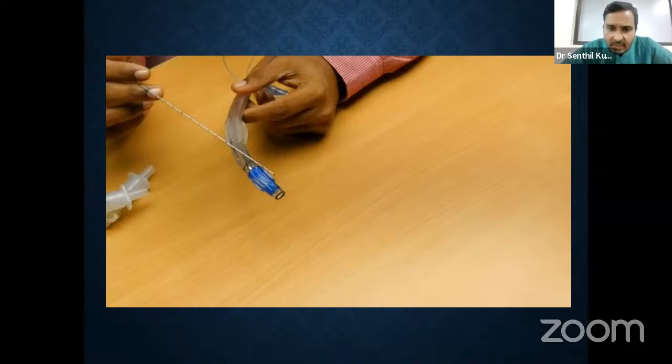That means there is a difference in branching between the right and left lung. For the left lung, the upper lobe bronchus takes off at 5 centimeters, whereas on the right side it takes off at a very short distance, that is 2.5 centimeters. So when you don't place the right-sided double lumen tube properly, there is a chance of obstruction of the right upper lobe bronchus. Whereas on the left side, since the margin of safety is very high, at 5 centimeters, the chance of obstructing the upper lobe bronchus is very, very low. That's why, unless for a specific peculiar indication, we will always prefer a left-sided double lumen tube.